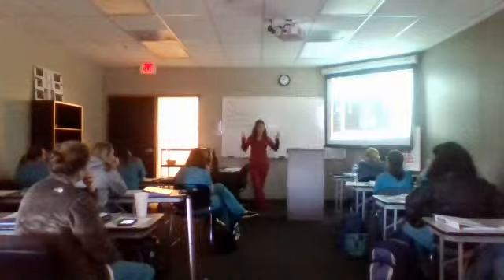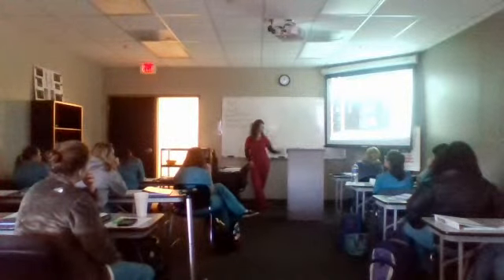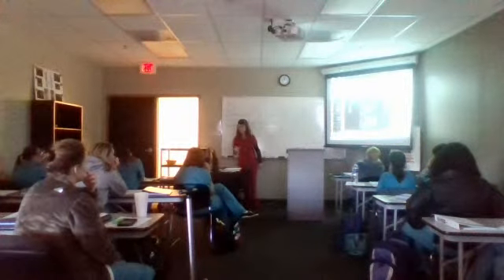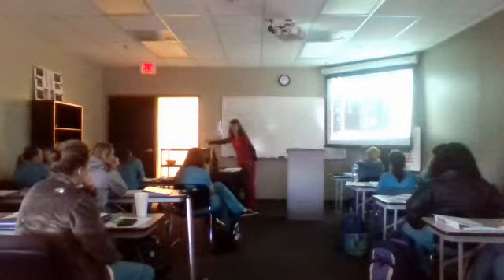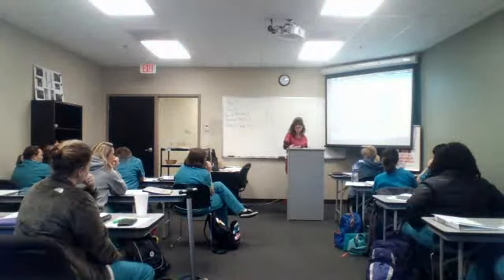That's the good thing about legs. There's no certain angle in long. It's kind of up to you, except for this one. This is the only one that has a certain angle. So a lot of people like doing legs a little better, a little more to some scanning wise, but anyhow. Okay, so that's just an example of what y'all just saw.